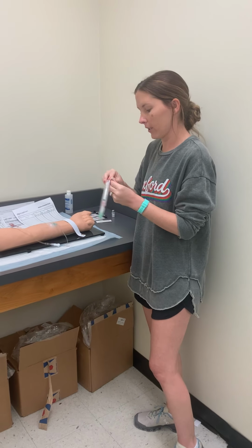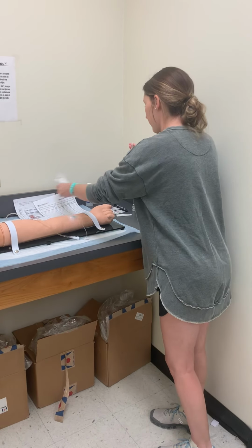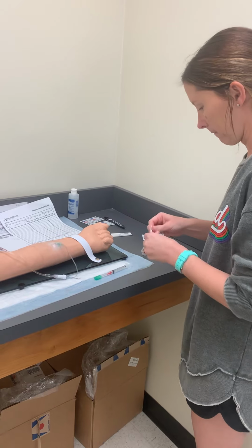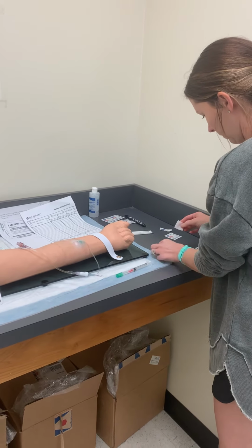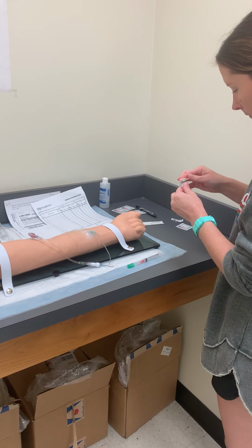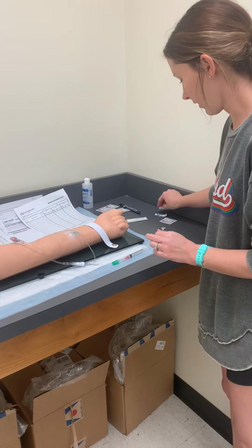I'm going to open my syringe, and my syringe already has my blunt needle on it. Okay, I still have the cap on. Okay, next I'm going to get my medication. It's already open. I'm going to clean the top for 15 to 30 seconds, making sure not to touch that again because it is sterile.